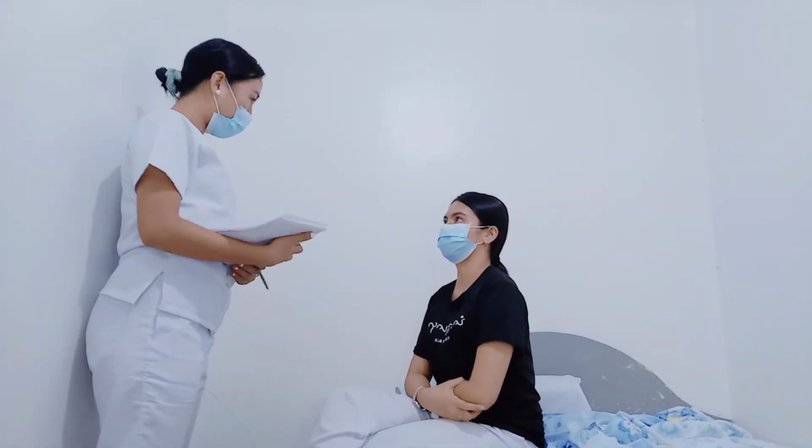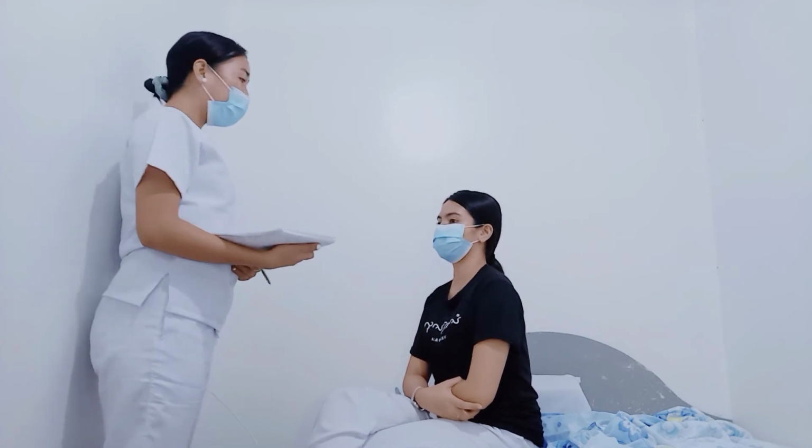Good day, ma'am. I am Camille Dungpa, your student nurse for today. Good day. Okay, ma'am. Today, I'm going to conduct the specimen collection. Is that okay with you, ma'am? Yes. Okay, ma'am. So, I have a few questions. Is that okay with you, ma'am?